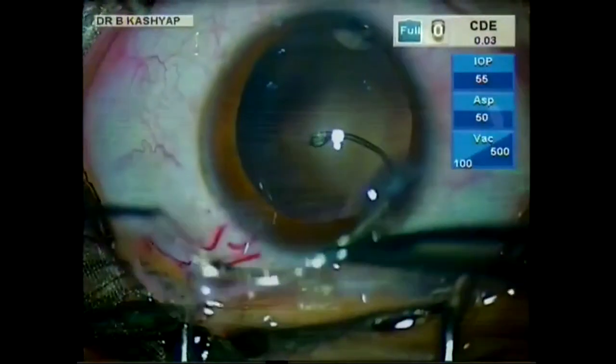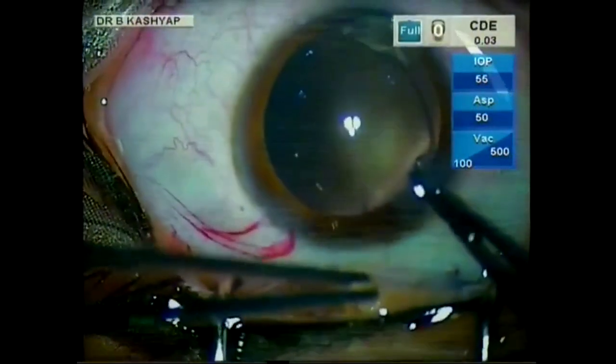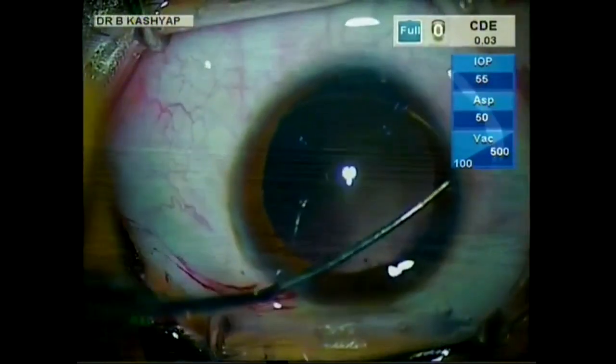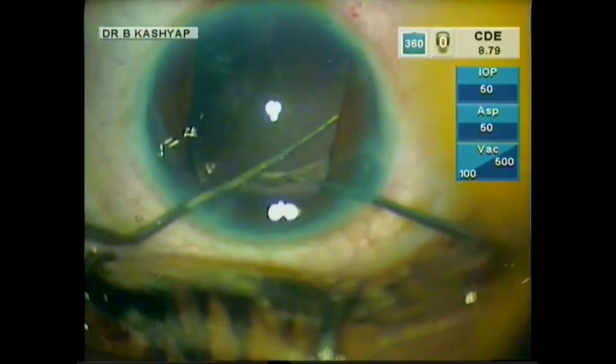A mature cataract with high IOP, puncture is done, capsular dehiscence was seen only after IA, CTR inserted clockwise, and forceps used to push in the bag but slipped. Sinskey hook used to engage the ring and pushed it in the bag. The trailing end of CTR was pushed by the Sinskey hook, and the other Sinskey hook helped the body of the CTR to get aligned in the bag, and the simple pressure on the body releases the Sinskey hook from the ring, and the CTR goes in the bag.